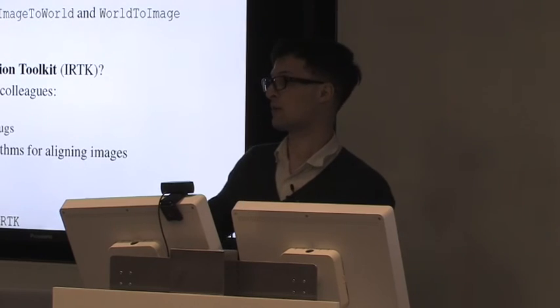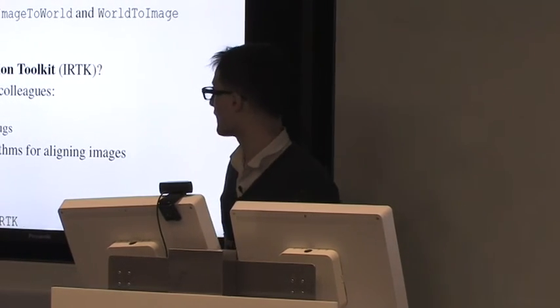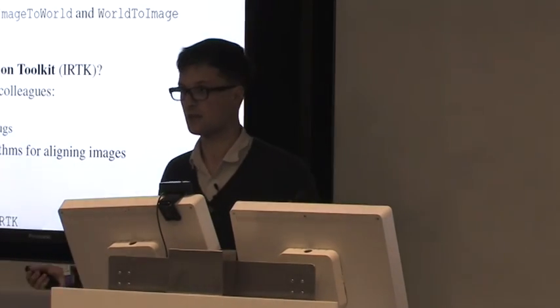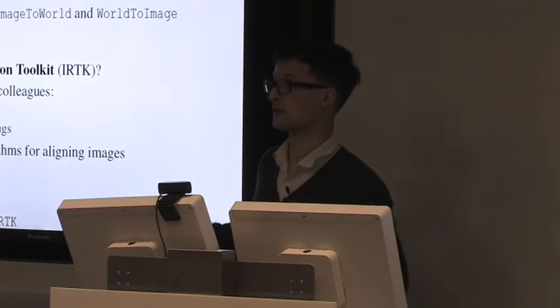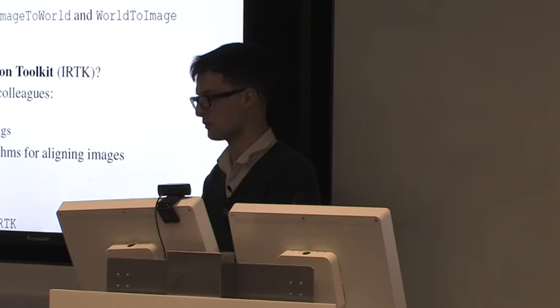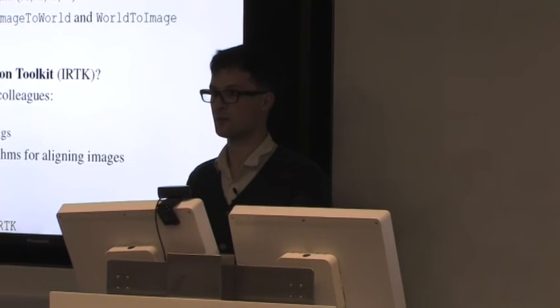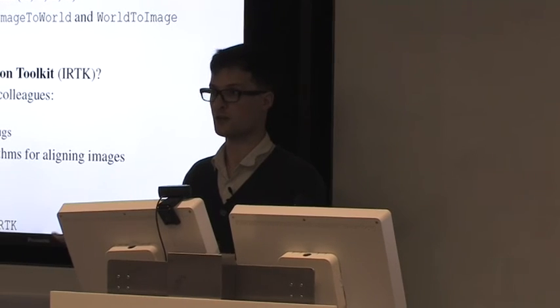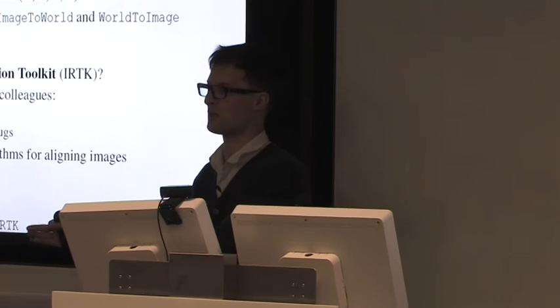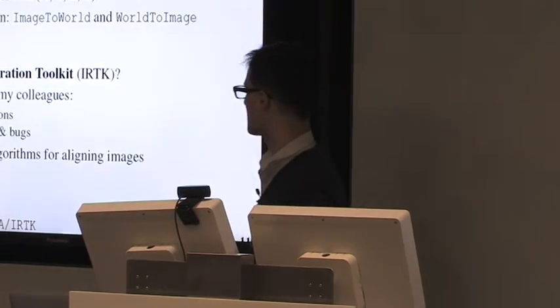Yeah, so if you use the same backend as your colleagues, then you've got the same features, the same conventions, because in medical images you've got conventions, what's left and right, for instance. And you also have the same bugs. And that's important because if you do half of your pipeline in Python, suddenly you do the second half in C++ and things don't work anymore. Where's the problem? Well, if you were using the same backend from the beginning, things wouldn't be working in Python. And then you would have debugged it, and you see what I mean.